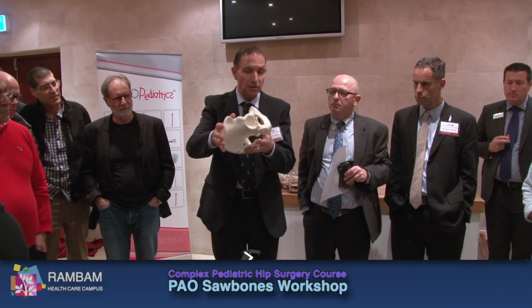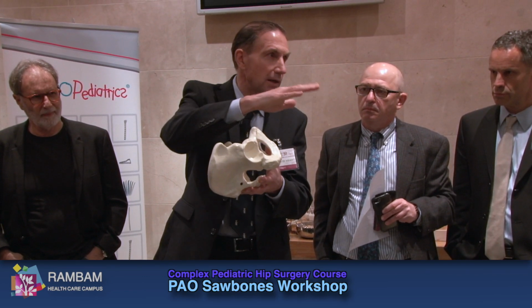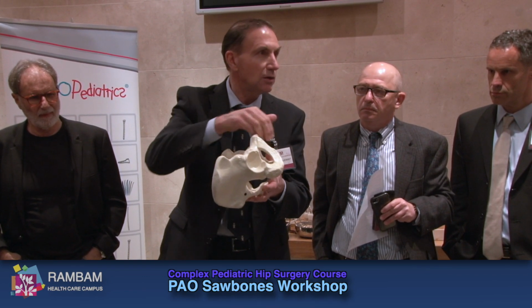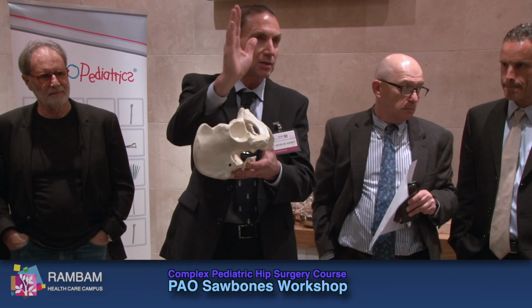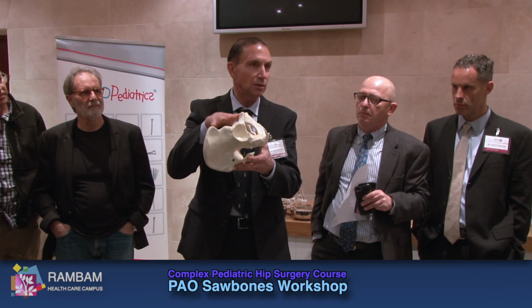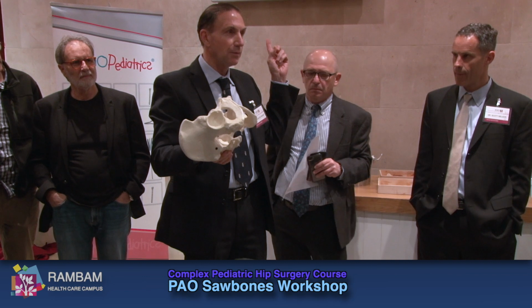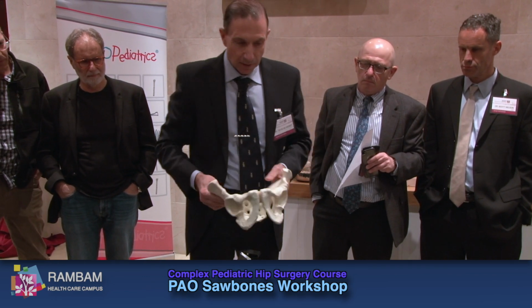Practice that. So you put the patient on the table, you get them to AP, you take them this way, you take them that way, you turn them this way, to make sure you can see all the bits of bone you want to see in the direction you want to see. Moreover, you set your AP on the intensifier so that the image you see on the table in that position matches the preoperative plan up there. Otherwise, you'll get problems with how you change it.